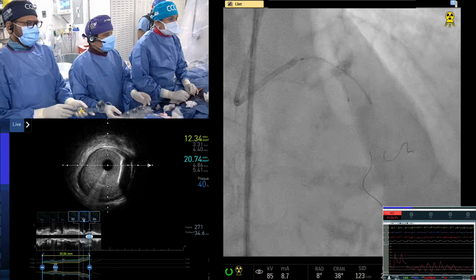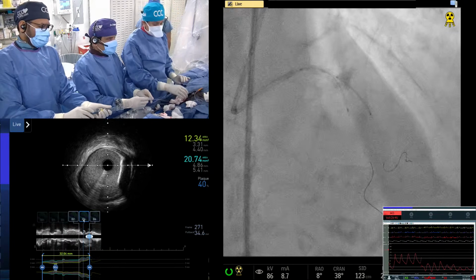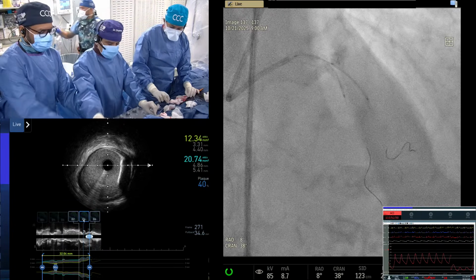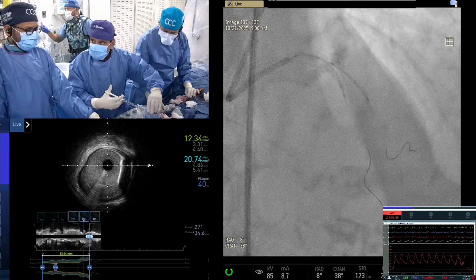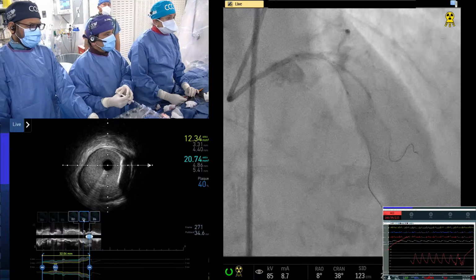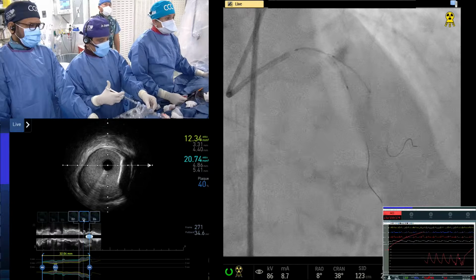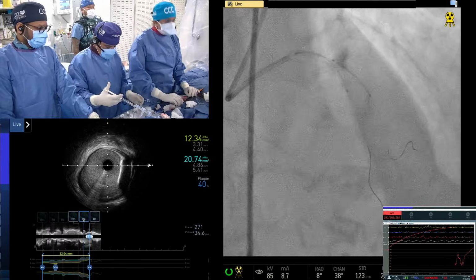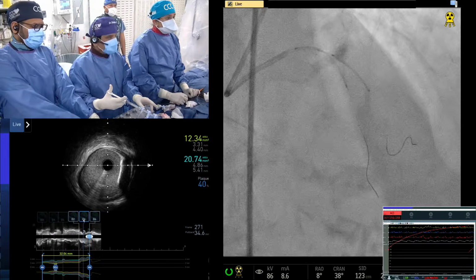No, it's good. It's good. Some dye now. Okay. Good. Leave it. Non-left main, mini crush, Felipe. He has it. Okay, some dye. Yeah. And see? Advance more. It's a lot. Advance the LAD. This is the LAD.